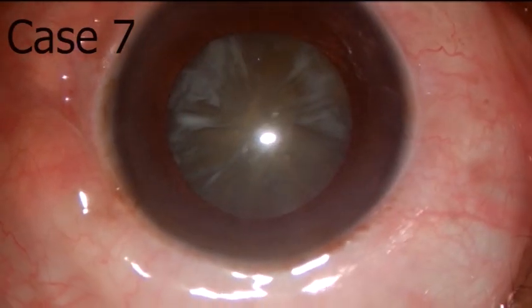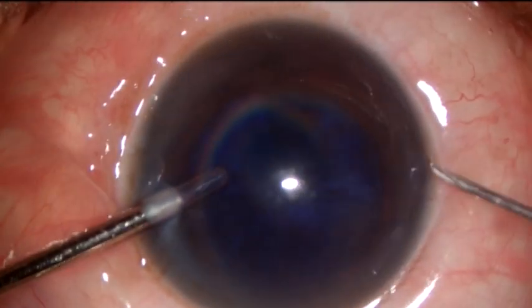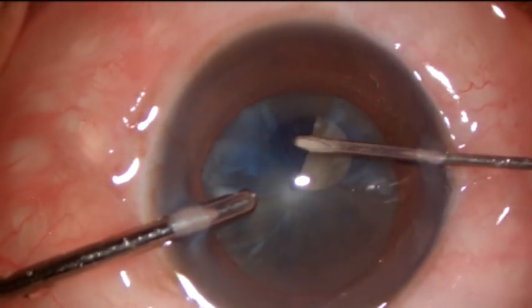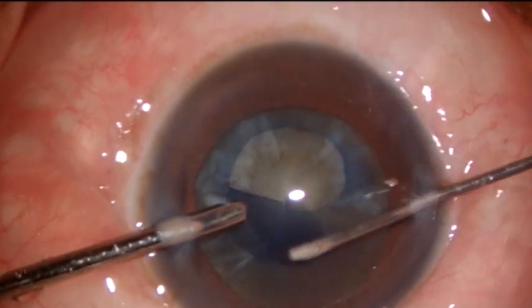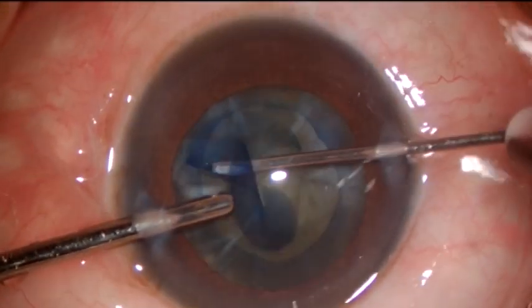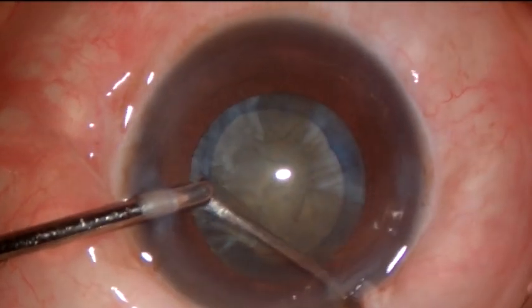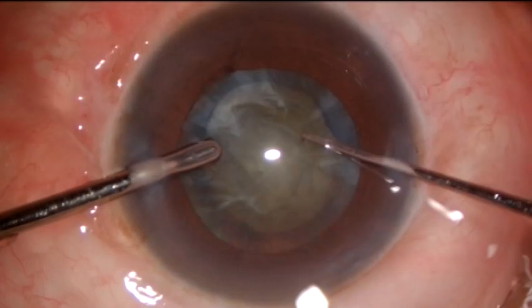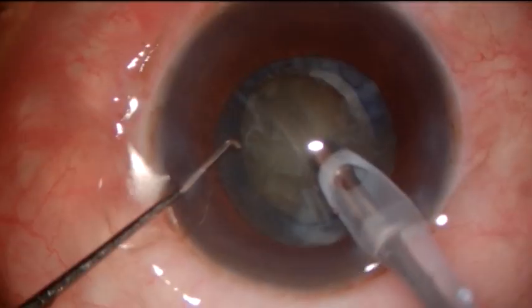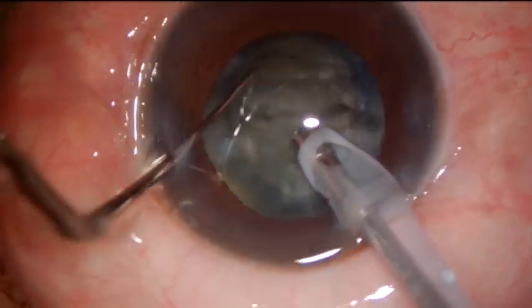While implanting the intraocular lens, a deep anterior chamber makes implantation very easy. We can even flip that IOL in the anterior chamber without damage to the endothelium. The irrigating probe again helps us as a second hand in easy tapping of the IOL and its rotation, which also avoids the step of IOL dialing with the use of a dialer.